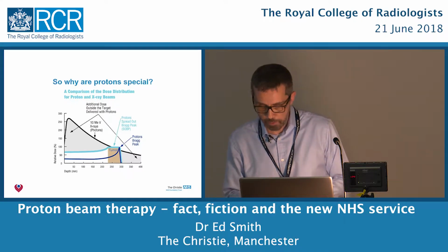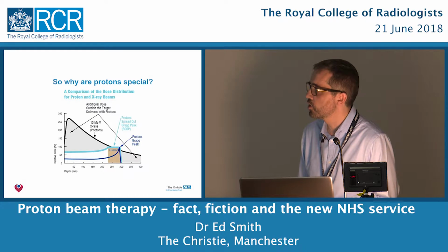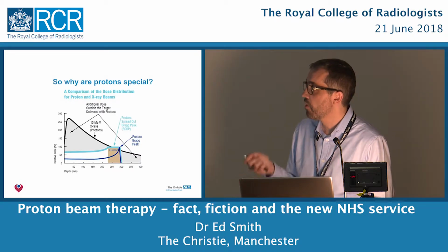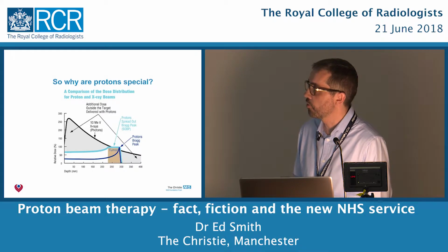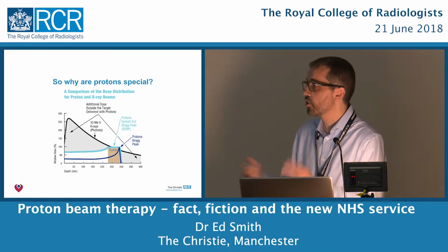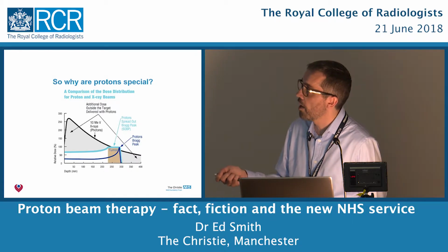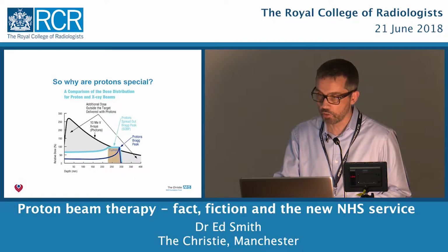Now there's a tumour there represented in brown. Clearly this Bragg peak is too narrow on its own to cover that. So what you tend to do is spread out the Bragg peak, and that's in the mid blue here. That's done by altering the energy of the proton beam. The higher the energy, the more it penetrates, and the greater the distance that the dose is deposited in the body. So by gradually reducing the energy of the beam, you can cover the extent of that tumour. And on this very simplistic representation, I've got to admit, the dose that you spare is essentially this area here and this area here. So less dose to normal tissues.